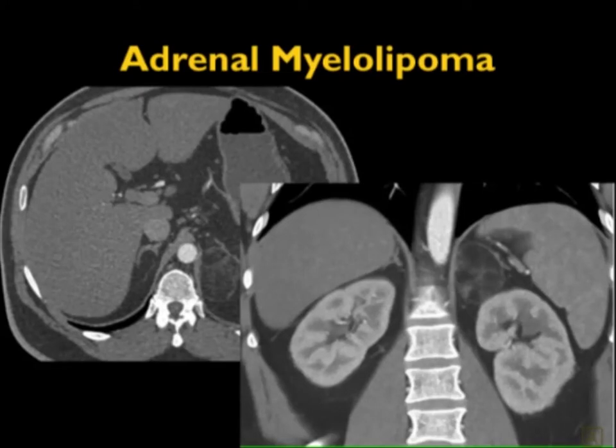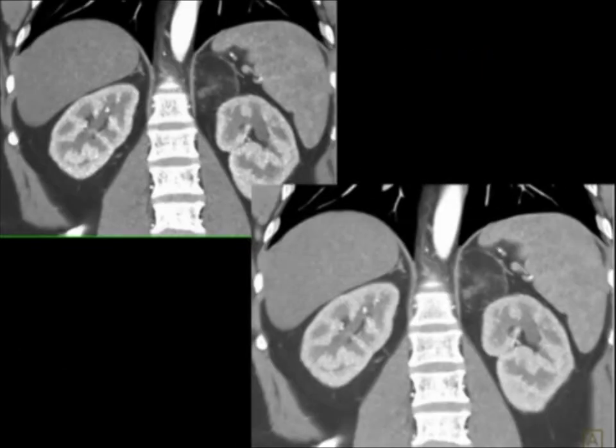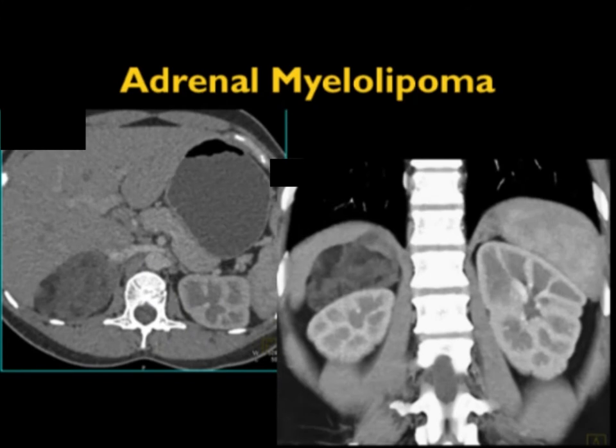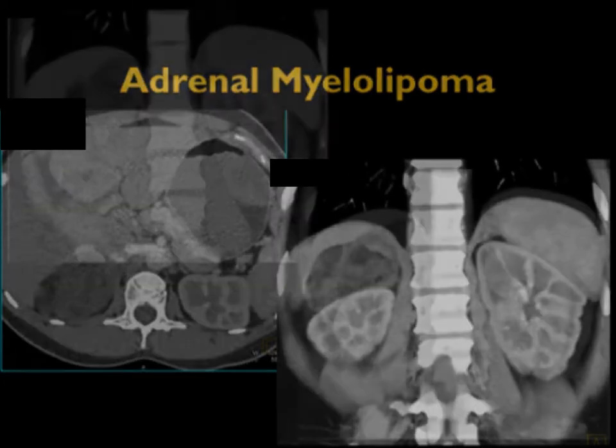Sometimes they have poor borders. Look at this myelolipoma of the left adrenal gland — very impressive indeed, with minimal stranding. One could have worried about hemorrhage. And here's another one — look at the size of this right adrenal myelolipoma, with a very heavy fat component and mottled density. It could have bled in the past, though there was no acute history of bleeding or pain. This is probably the kind of lesion that will be removed prophylactically because of the risk of bleeding, its density appearance, and its size. Here it is very nicely in the coronal view.